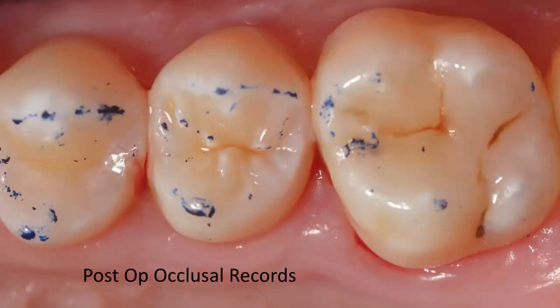This is the post-op occlusal records to see whether the restoration is high or in occlusion. By changing the slight spots, you can change and play with the occlusion of the patient. So by maintaining these spots well in occlusion, the patient can utilize his teeth in the pattern he was using previously.